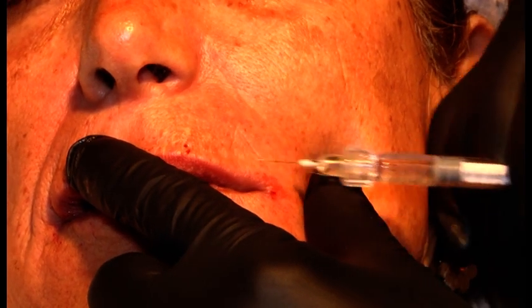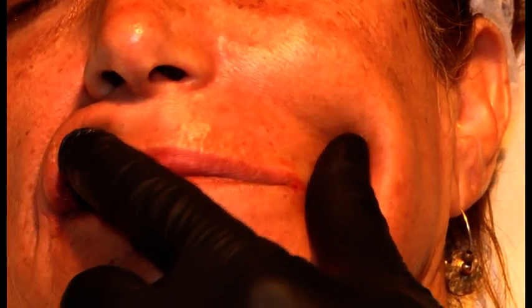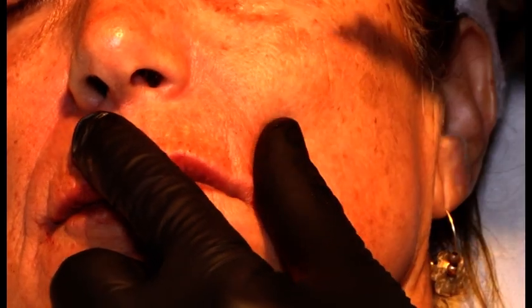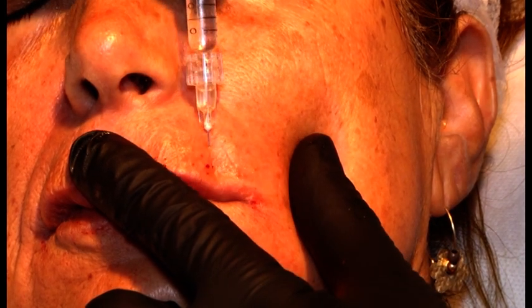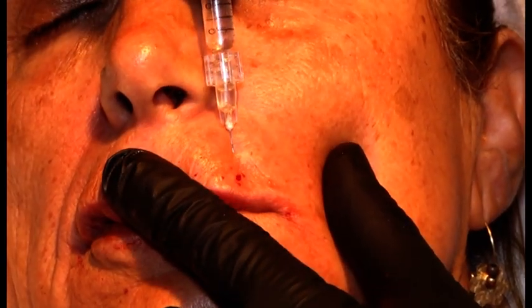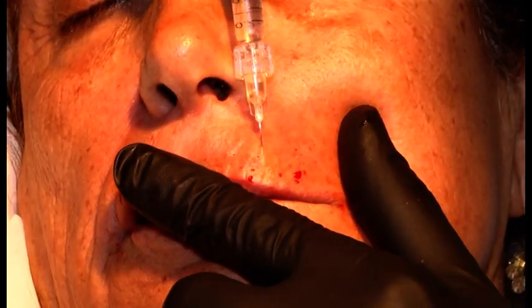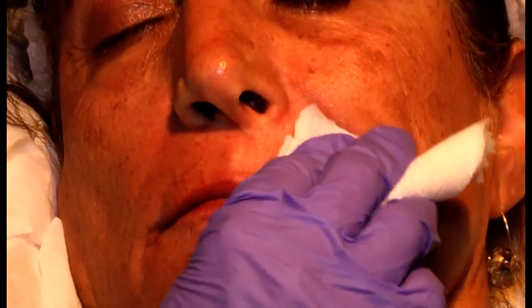Okay, so you get the idea, right? Small drops, starting to blanch. As you can see, it's a little bit white now, but it will become less white after a while. Of course, it's also possible that with Belotero you do the standard line filling technique like this, retrograde linear threads, which is not really the blanching technique, but it works too, as it's like a standard HA technique. And especially for wrinkles a bit deeper, it's good to do it like this.